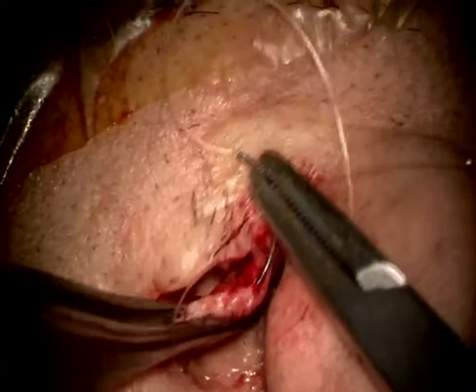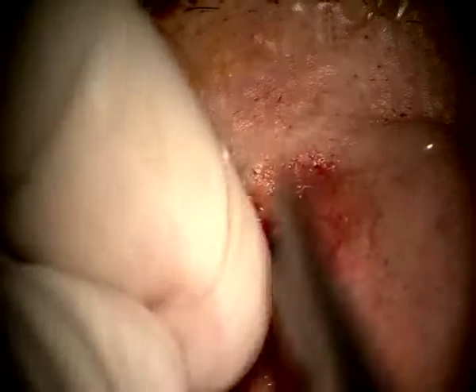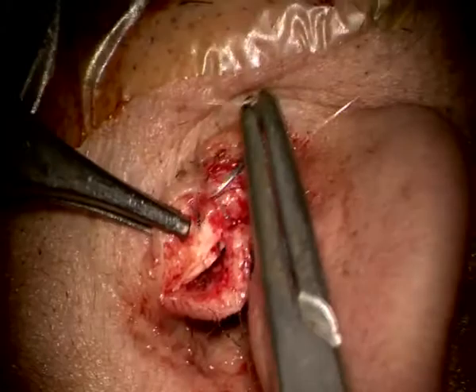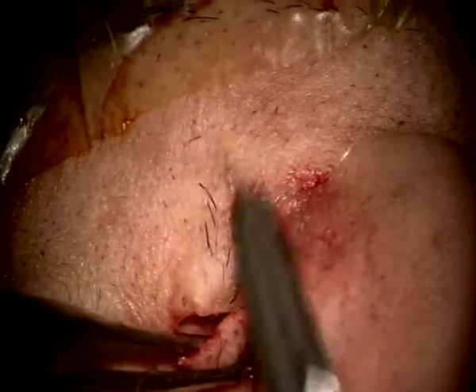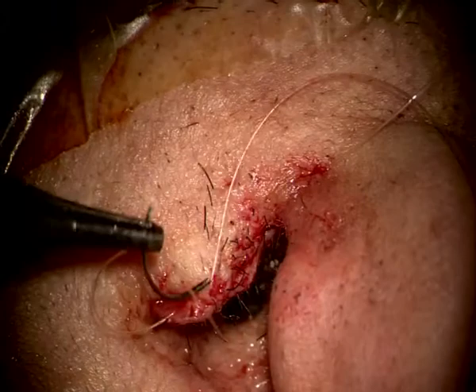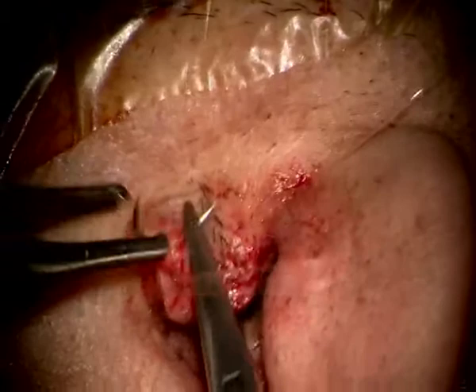But I find this a lot easier to do with the microscope. Mainly for age reasons, this time. As you mature as a surgeon, your eyes also mature and you end up with a bit of difficulty seeing things. So, finishing up my subcuticular stitch. Of course, you don't want to lock it. Makes it hard to remove. So, here we go. We just finish up our subcuticular stitching.